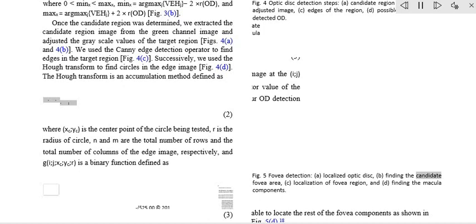Performance measurement of retinal IQA. Figure 8: examples of EROD. A, optimal boundaries for EROD. B, an example of a retinal image having OD and fovea in EROD. We implemented our feature extraction code using the MATLAB software. We executed the DRIMDB feature extraction on 2 different computer configurations, PC1 and PC2. PC1 has an Intel Core i7-3770 quad-core CPU with 16 GB of RAM, and PC2 has an Intel Core i7-3930K 6-core CPU with 16 GB of RAM. We repeated feature extraction experiments 10 times to eliminate the cache effect using serial and parallel implementations. Moreover, we calculated the speed up and efficiency scores for the parallel implementation of the feature.